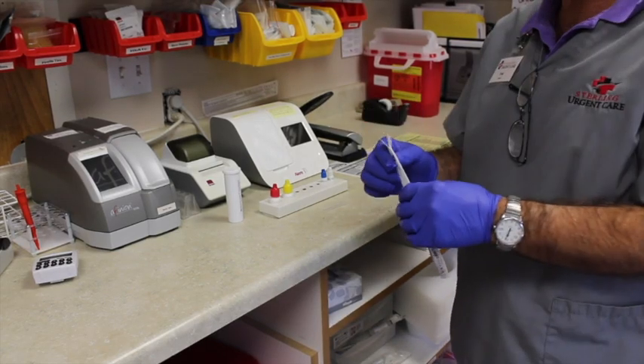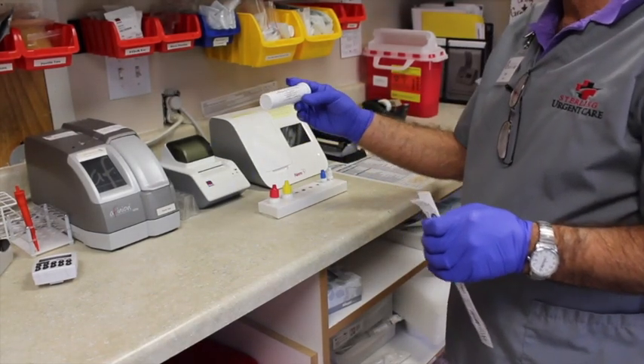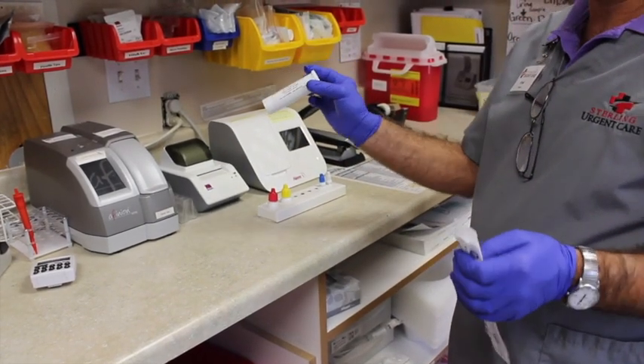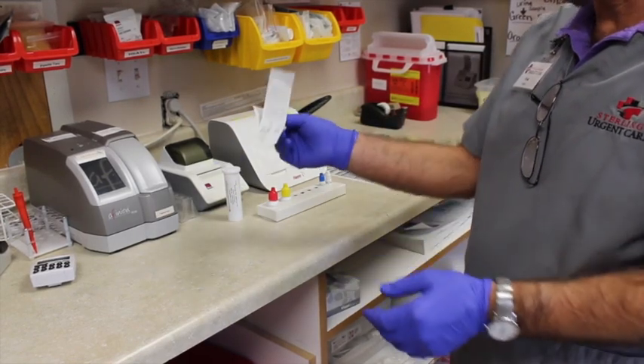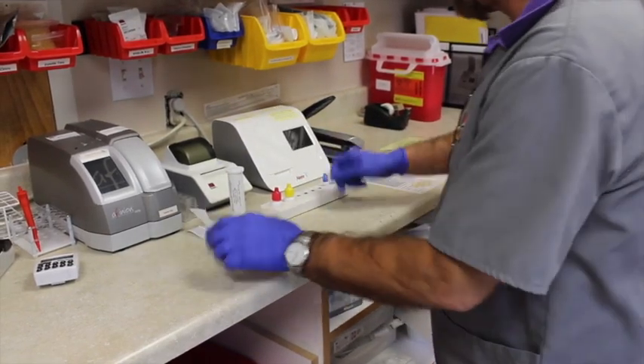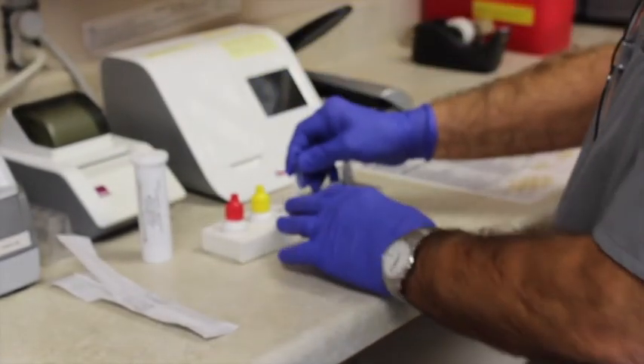We're going to do a rapid strep test, and we're using the one-step Henry Schein rapid strep. We've already collected the specimen on the swab, and so you want to use the little tube here.